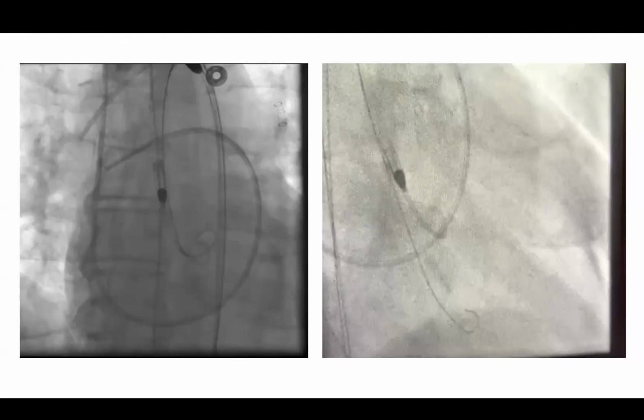Carlos, the case reports of snaring to push it back in that I've seen have been radial. Do you think it could be done as easily from below? Yeah, I think so. As long as you get a good snare there, I think so.